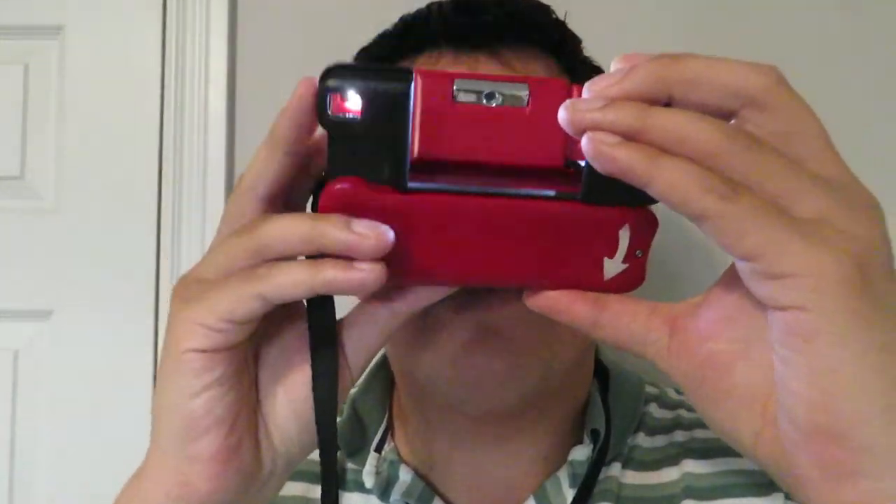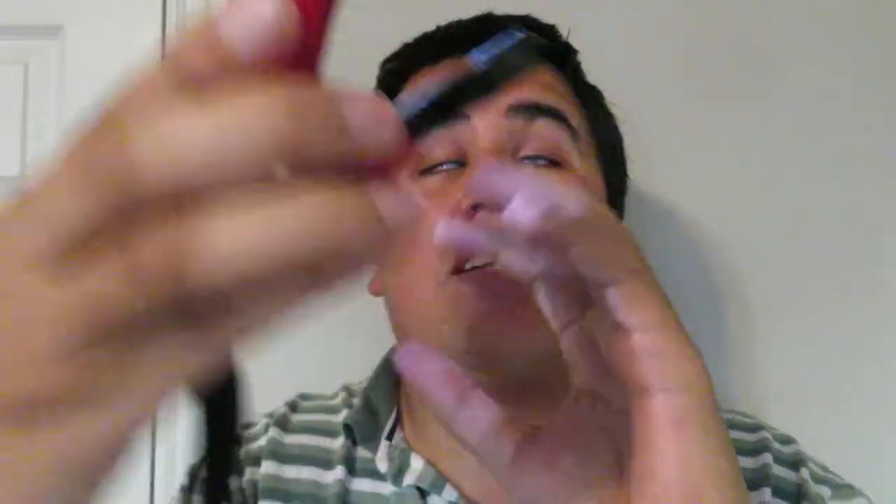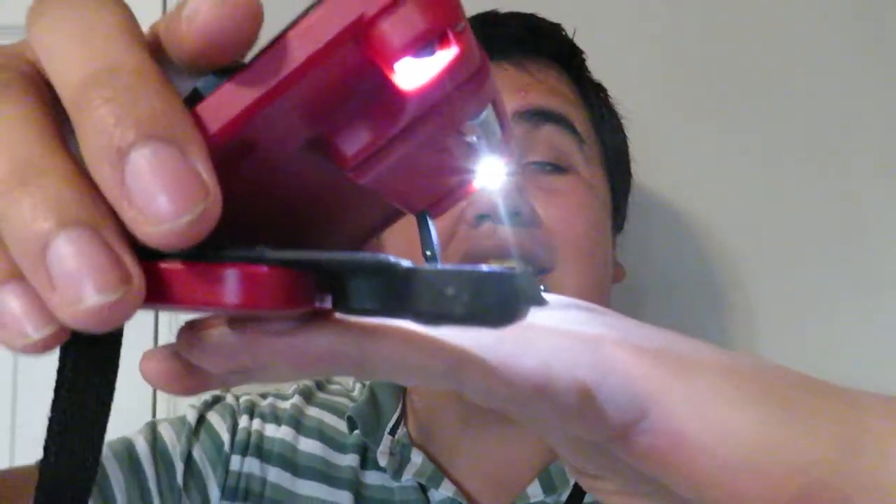So if I'm reading a book, I'll be able to read, and you can actually open it like this. When you put it down, it goes on the book like so. And it's really awesome.